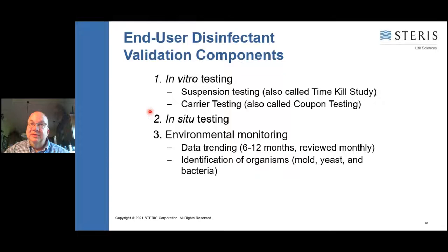Then another key component that's actually very important in the industry today, both to FDA and other global regulators like CFDA, MHRA, HPRA, is the in situ field trials, because you need to be able to show the regulators under worst case conditions that you can control that bioburden in the facility. So that's very important. That's another topic I'm going to be covering this morning with you.